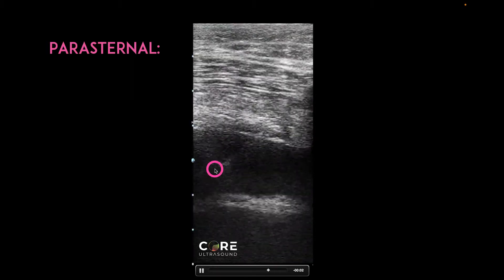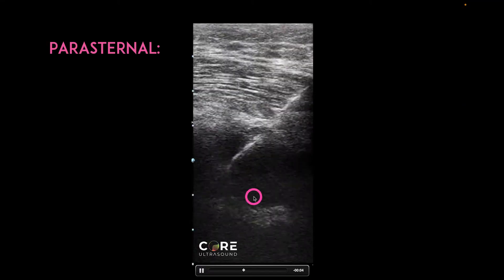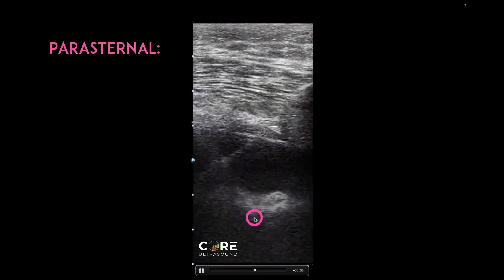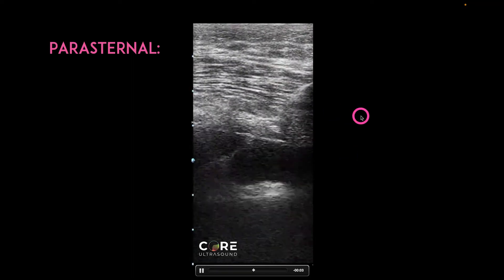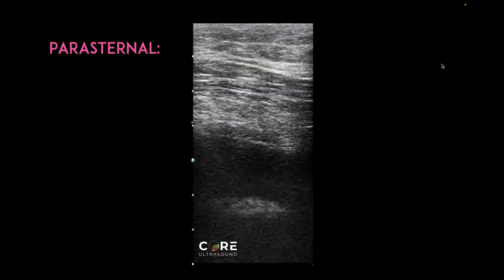Here you can see the needle with the guide wire actually already in that fluid. Here is the heart. You really only need to see just a centimeter or two of that cardiac border because you don't need the whole thing — you just need to be able to see the needle go into that fluid. This is likely the most accurate you can be, especially when the effusion itself is not that large.